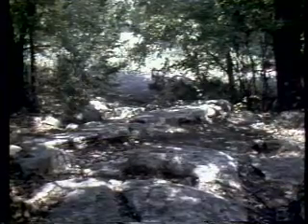Here we see the team beginning to move up a hill. They're going to have to rotate the patient again to keep the patient's head close to the ground. After they've rotated the patient, the number 4 person again slides to the rear of the litter to provide that additional support. The number 1 team leader can then, in this case, move up the hill slightly ahead of them, helping them pick the path, moving them around branches, trees, things of that nature.